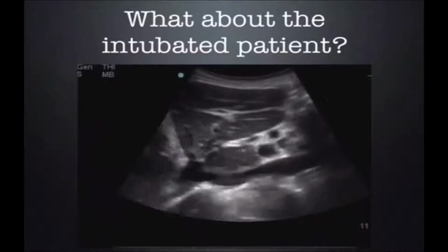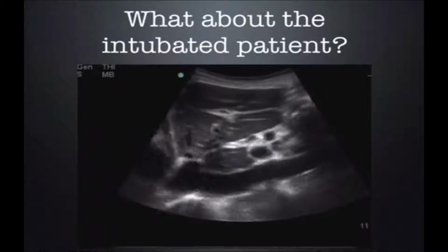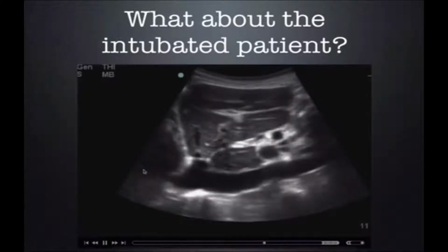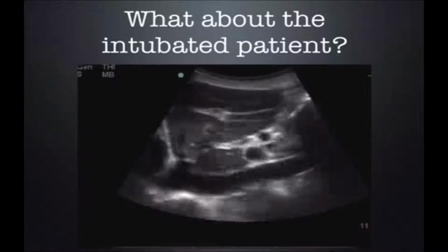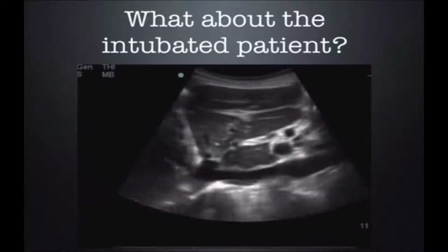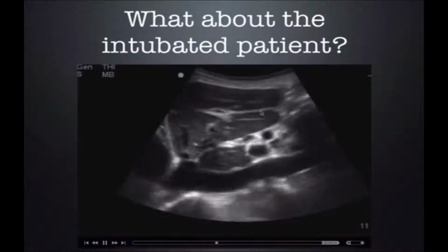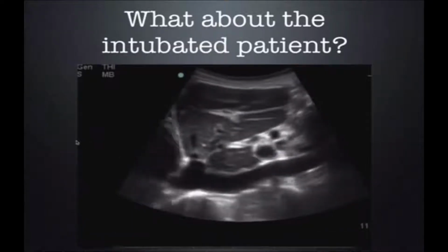So up until this point, we've talked about patients who are spontaneously ventilating. Patients who take their own breath generate a negative intrathoracic pressure which pulls air into the lungs. Not only does negative intrathoracic pressure pull air into the lungs, it also sucks blood up into the thorax, just like if you were drinking water or a Coke through a straw, you generate a negative pressure in the oropharynx which pulls that drink up into your mouth. At end exhalation, the IVC is at its largest diameter. Here the patient takes a breath in, the diaphragm and the liver go down towards the feet, narrowing the IVC.